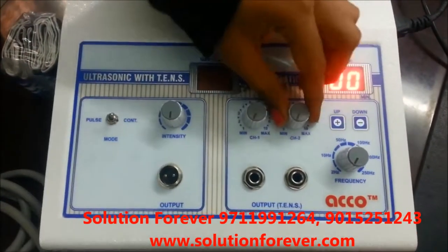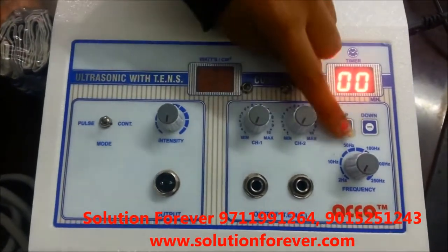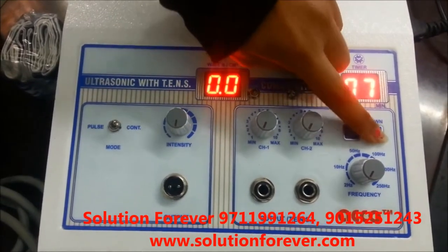Make all the intensity knob at zero. Set the timer as per you need. Timer up. Timer down.